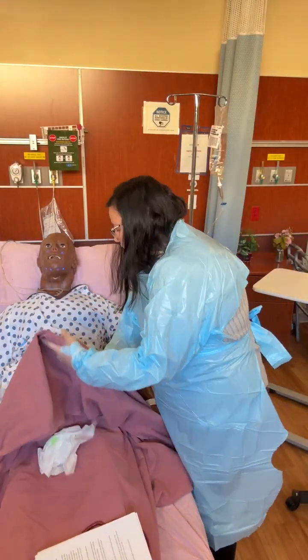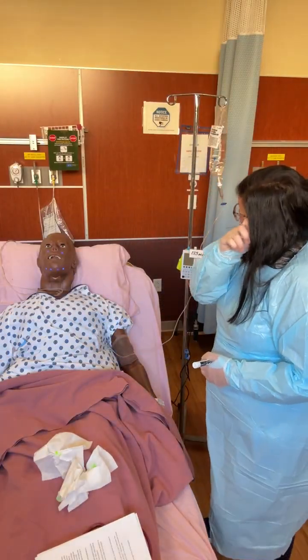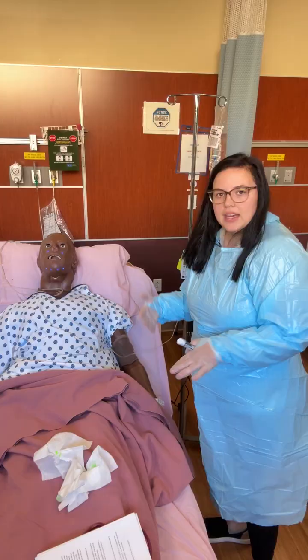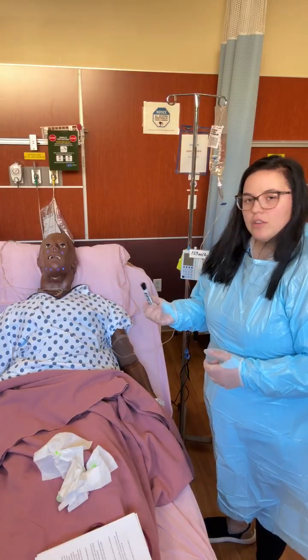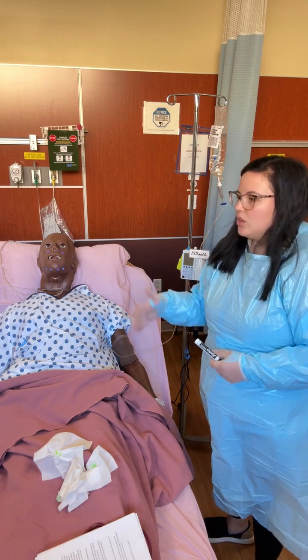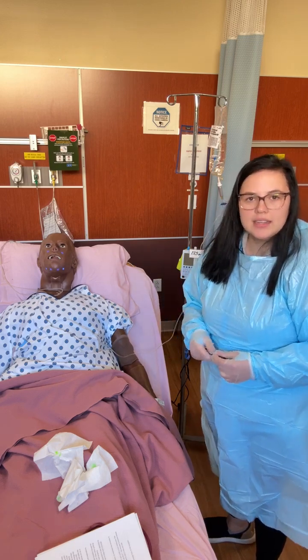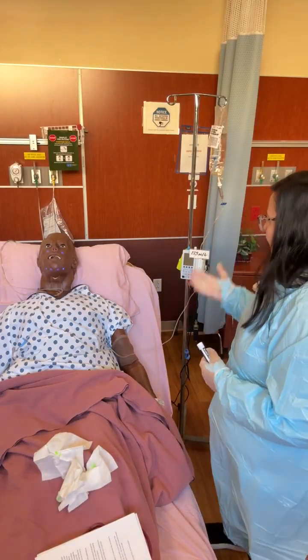Please make sure that you're talking to the simulator as a patient. Communicate with him and listen to what he says. As sim staff, we're playing a part. It's all a script, and he's trying to cue you or tell you things, so listen to what he's telling you. And then you are allowed to move the bed up and down.